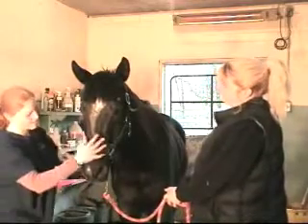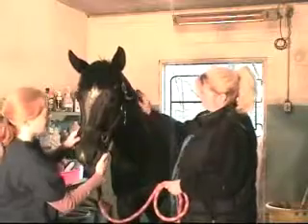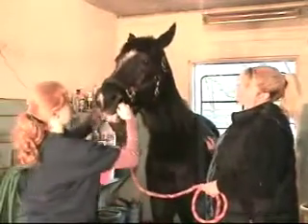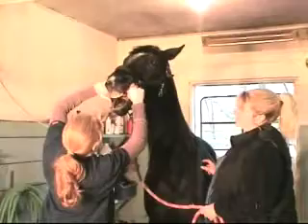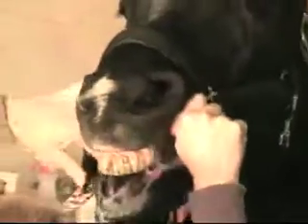So we're starting to get a little sleepy here. You can look at his eyes. And just kind of coming up along the side, I can feel just some sharp edges in his teeth. And you can see horses have quite a few teeth back there. It's kind of hard for you guys to see on the camera, but he's got some food and hay that he's kind of saving for later, which we'll have to get all that out. His teeth aren't too bad.